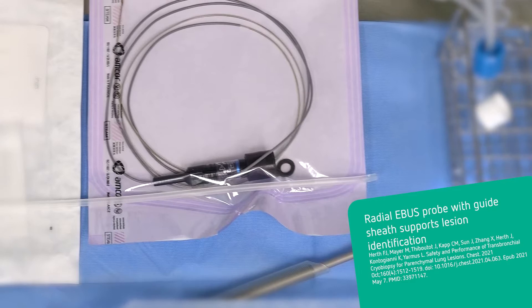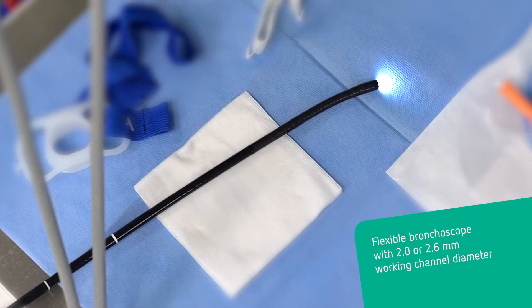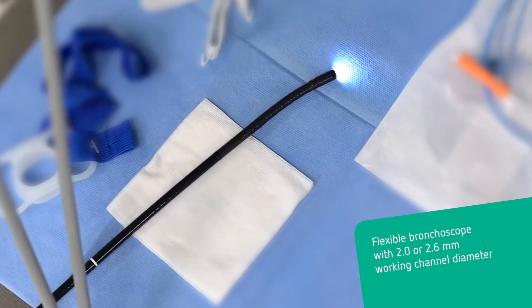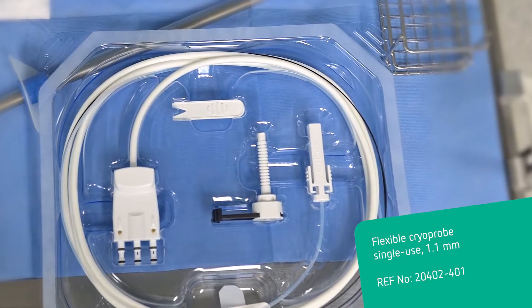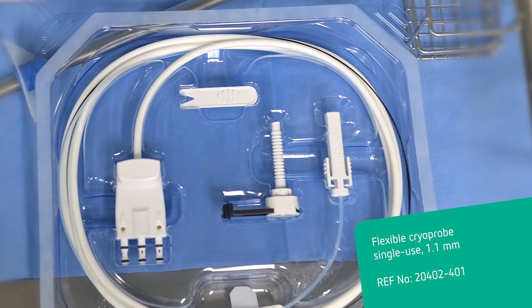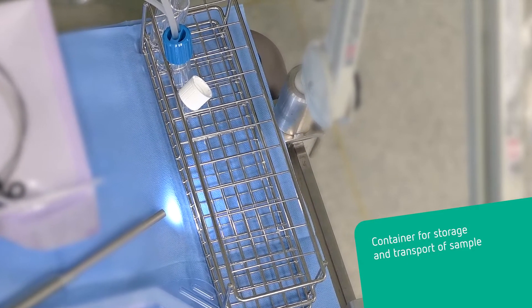A radial eBUS probe along with the guide sheath is used. A bronchoscope with a working channel 2.0 or 2.6 mm in diameter can be used. The flexible single-use 1.1 mm cryoprobe is used for this procedure. A dedicated container serves for sample thawing and storage after removal.